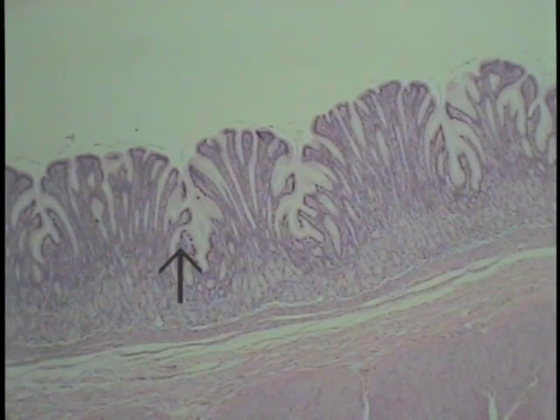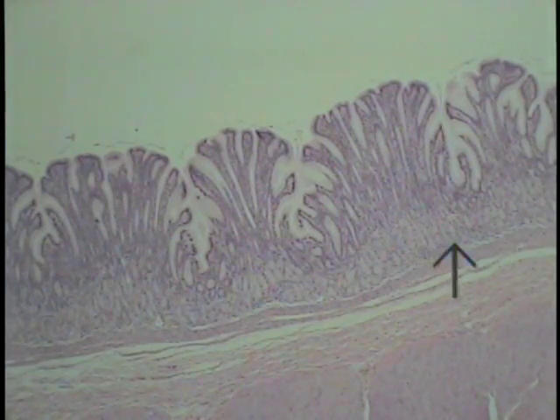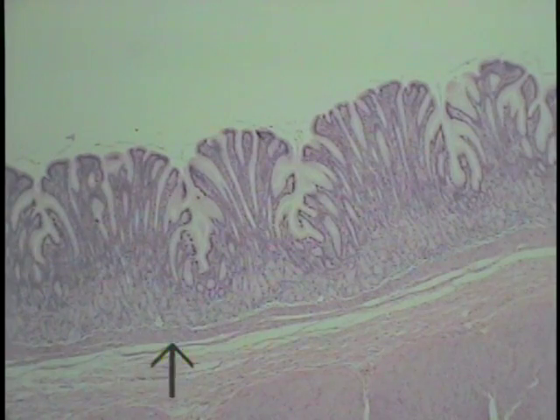So several of these gastric pits, and then these mucus appearing glands, as indicated by the pointer, are the pyloric glands, which will then terminate or empty into the bases of the overlying gastric pits. Also shown quite discreetly is the muscularis mucosae, as indicated by the arrow.